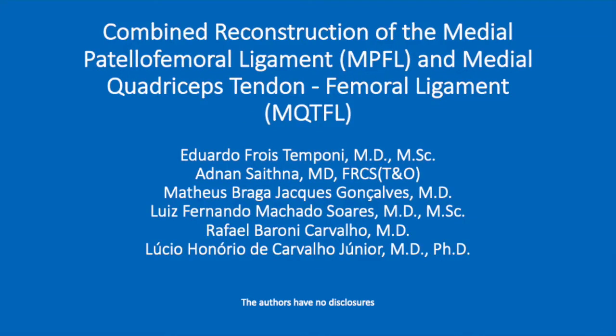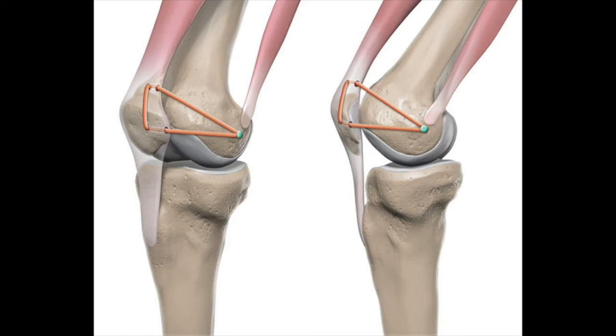This video demonstrates the surgical technique for combined medial patellofemoral ligament reconstruction and medial quadriceps tendon femoral ligament reconstruction. The procedure utilizes a semitendinosus autograft, which is passed through an osseous tunnel in the patella and a soft tissue tunnel in the quads tendon before being secured at Schöttle's point.